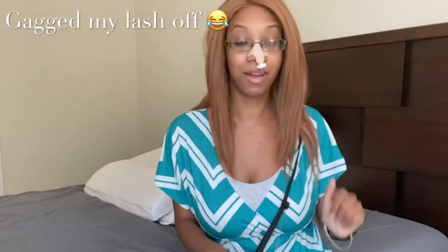We are back. So today is the day after the placement. After it was placed, I did the manometry test with the impedance. Basically yesterday I went to the hospital. Due to the coronavirus being out, you have to get a coronavirus test within five days of your procedure or test. So I got my coronavirus test done on Friday. It came back negative the same day, so I was clear for Monday, yesterday, to get my test done.